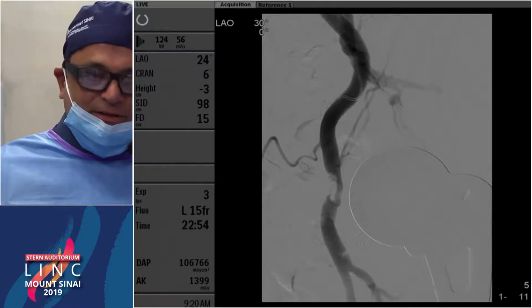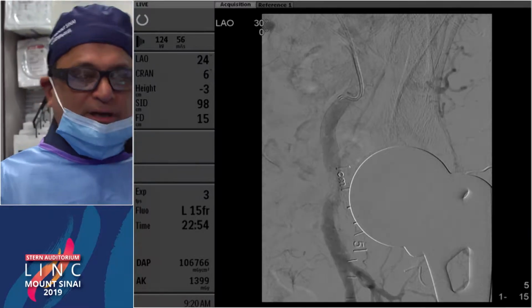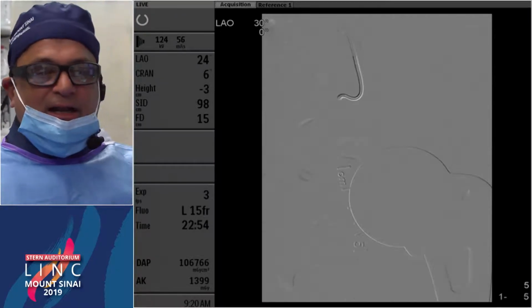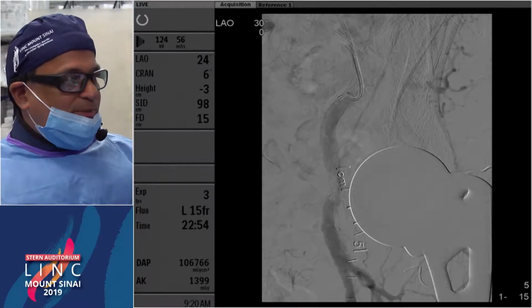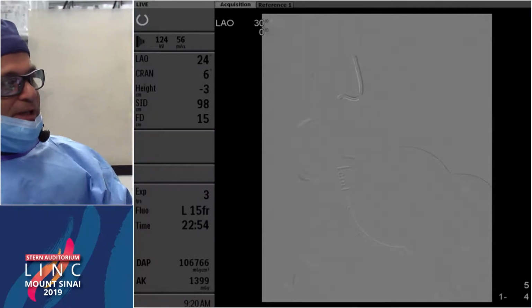We did an IVUS, and Brian, our thought process was similar to yours, and like Chris said as well, is get her out of rest pain. You know, she's an elderly lady with severe pain. So we decided to just open the common femoral, and obviously she's had a prior hip replacement. She's got other things going on, but nothing that's preclusive. It's her EF that was the reason they didn't do it.